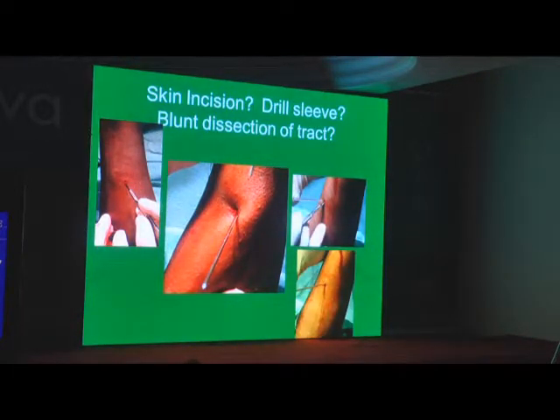Here is the same pin track which has been released with a stab knife — a little extra cut on that side so you don't have difficulty finding that path. You made that cruciate incision — it is a very small skin cruciate incision. Don't go deep; you don't want to touch the nerves in that area.